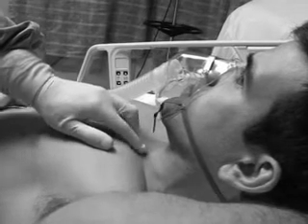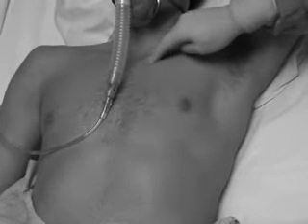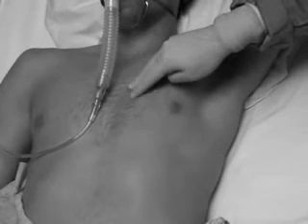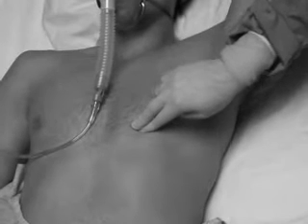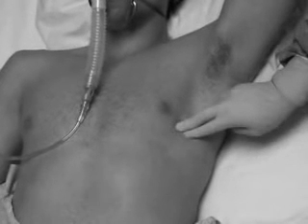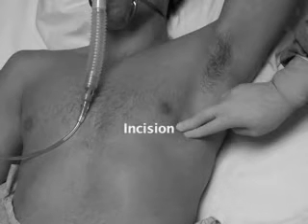Start your landmarking by localizing the clavicle. Next, count the rib numbers as your fingers traverse down the anterior chest wall. Once the correct intercostal space is found, move your hand along the space laterally towards the anterior axillary line. The incision will be made here. The chest tube will actually be inserted one intraspace above this point. Mark the incision spot with the imprint of the back of a needle or a pen marking.